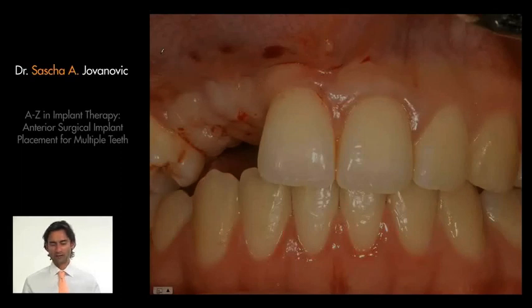So the central incisor and the first premolar did not have enough root attachment to validate a traditional prosthetic treatment of a four-unit bridge. So implants came into discussion. Again, gingival tissue was analyzed. It looks to be thick and abundant. Bone tissue was analyzed, and there was not sufficient bone available.